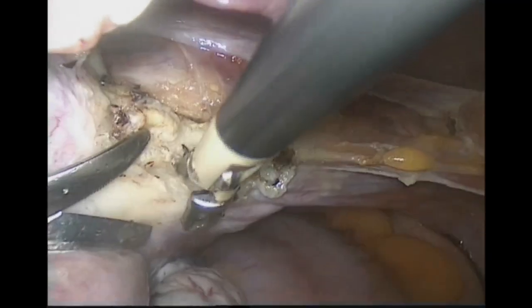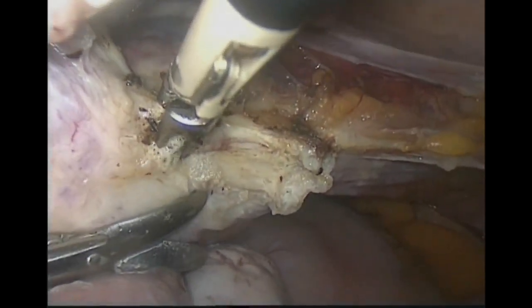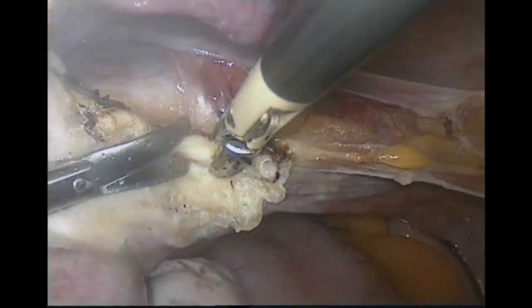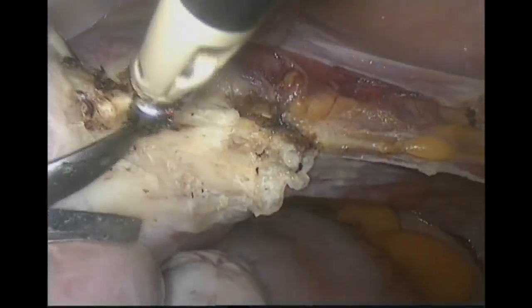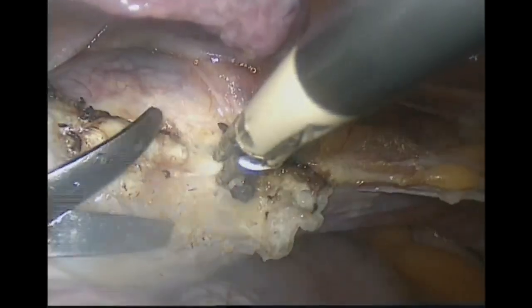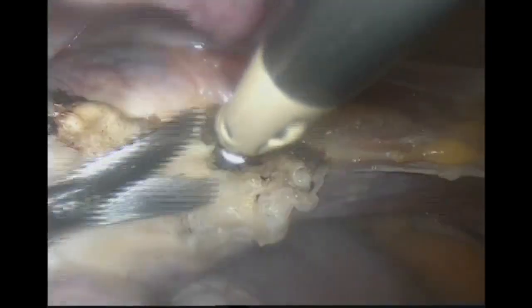It is very important to push the cup upward, cephalad, and to go to the uterine artery in a vertical part, hugging the uterus as you did before when hugging the ovary to take the IP ligament. So here, hug the uterus to take the uterine artery, in a simple and smooth way, to avoid injury to any part of the ureter, and to avoid any injury during colpotomy and separation of the cervix from the vagina.